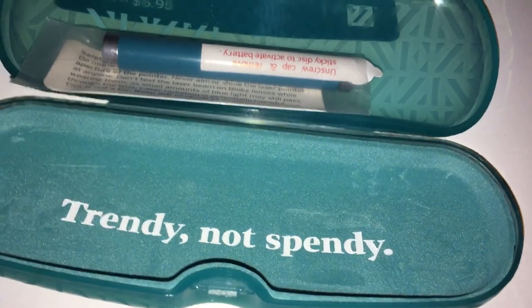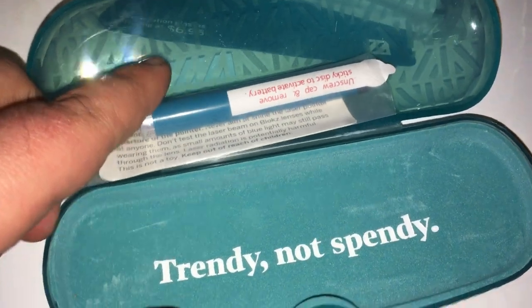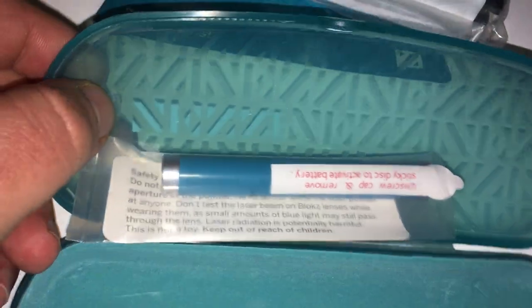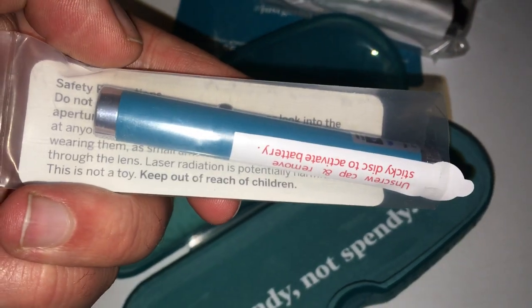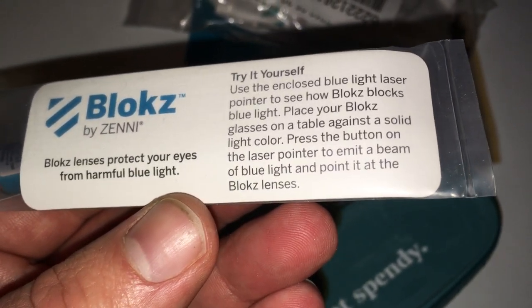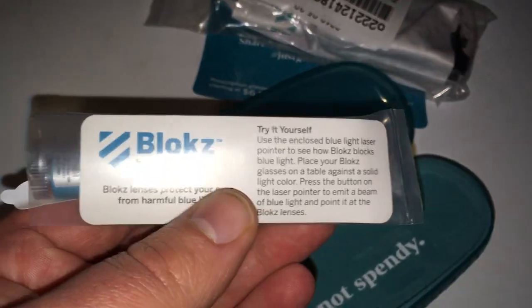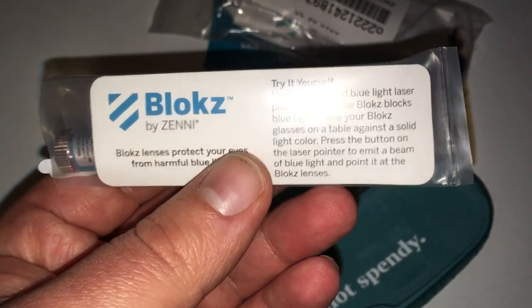Let's open this up. The first thing I'm noticing — there's this thing right here. It's kind of a nice soft material here and then hard plastic here. It seems like a pretty nice case, but right here we have like a laser light pointer — 'Blocks by Zenni,' you can pause and read that. Essentially they give you a laser light pointer so you can test out your lenses and see how it blocks your eyeballs from the bad stuff.